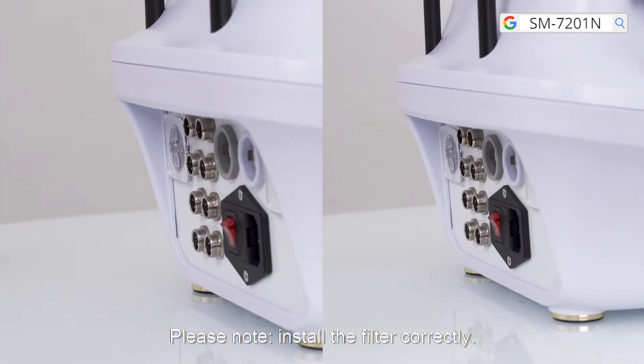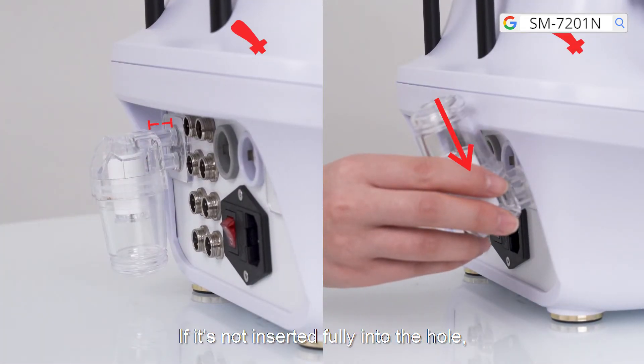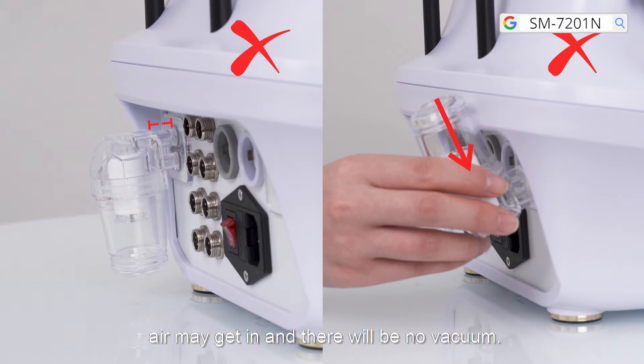Please note: install the filter correctly. If it's not inserted fully into the hole, air may get in and there will be no vacuum.